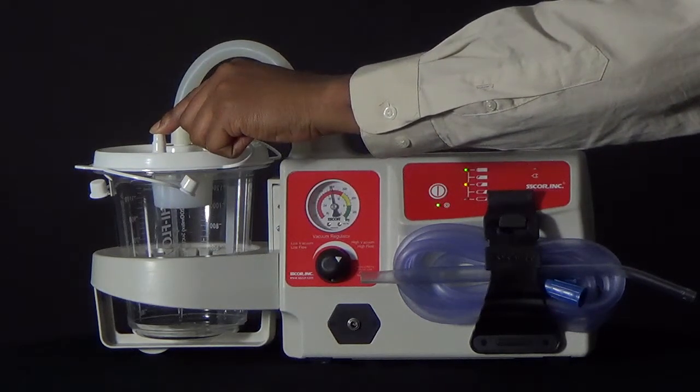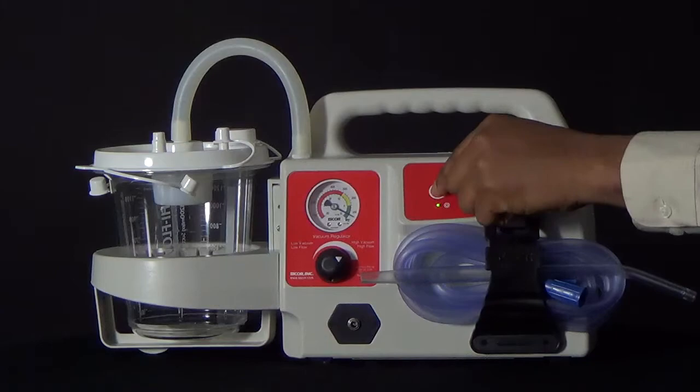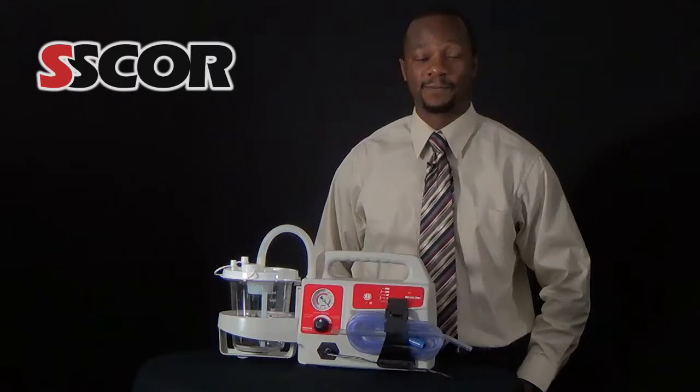If so, then you know that the device will give you effective vacuum for at least 15 minutes. The SCORE aspirators previously mentioned will run for 30 to 45 minutes depending on the device when the battery is fresh and new.